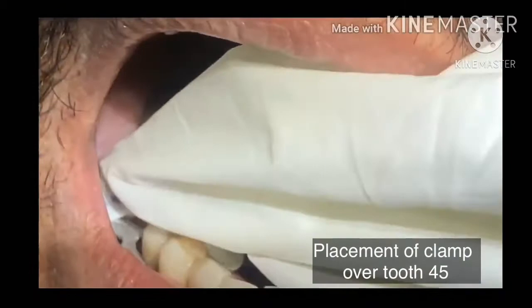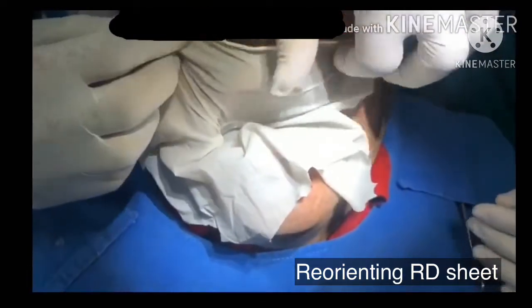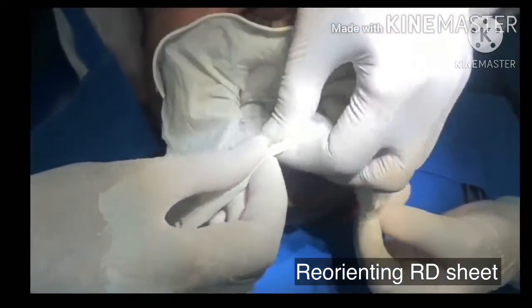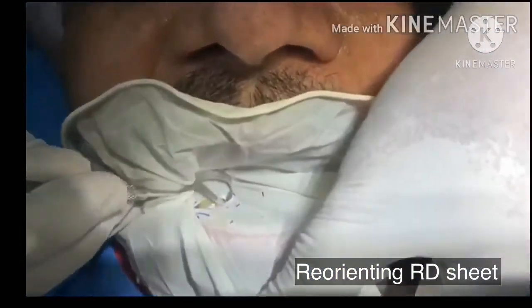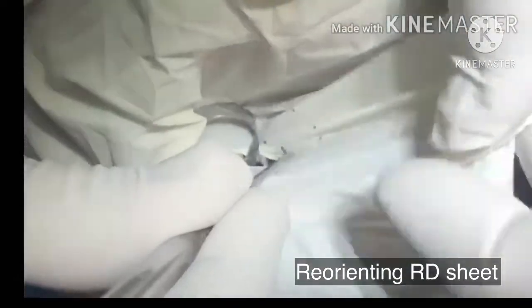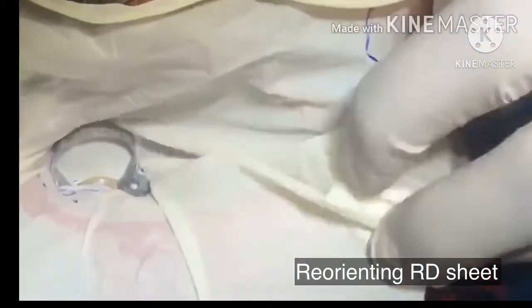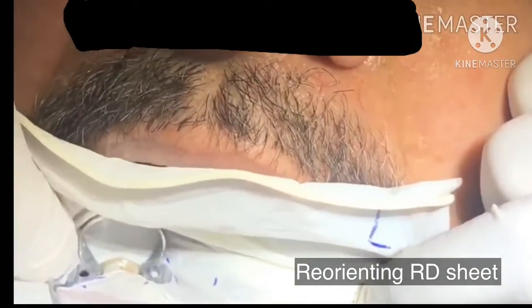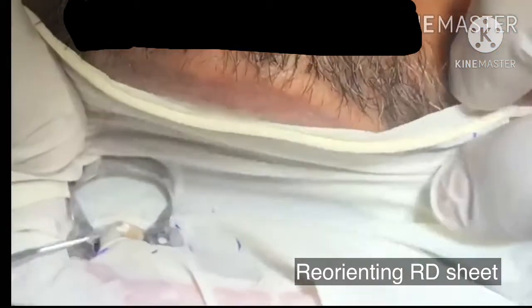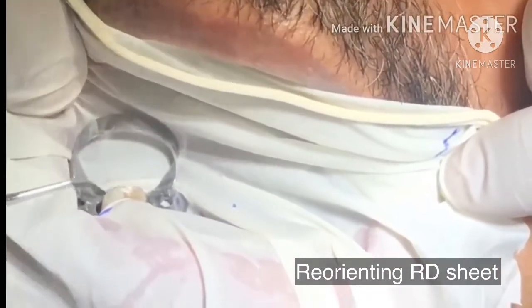After this, it is turned and we look for the upper side first. As I have told you, right comes on the right side of the patient and left comes on the left side of the patient. After this, we make a simple stretch, and with the help of a plastic instrument we slip the wings of the clamp. Similarly on the other side. If there is a gap, we can lift it up or adjust it so that it covers.